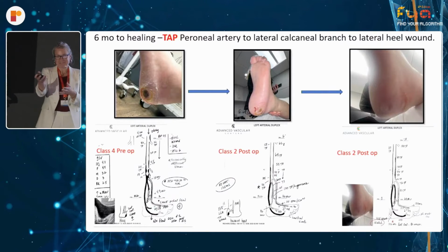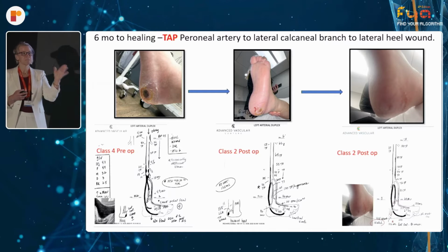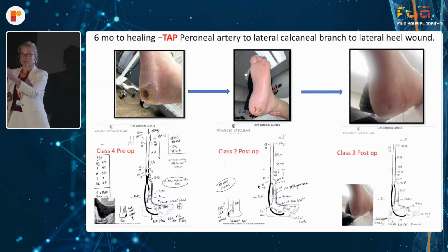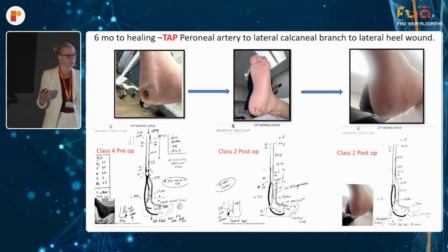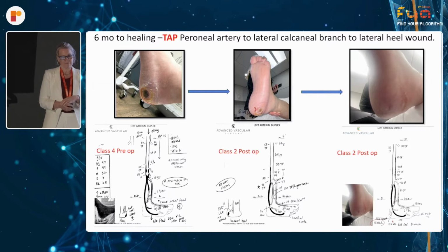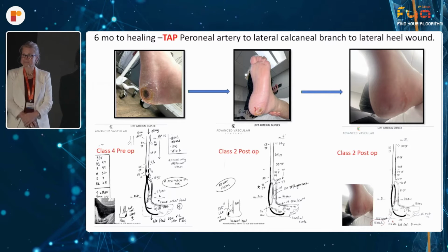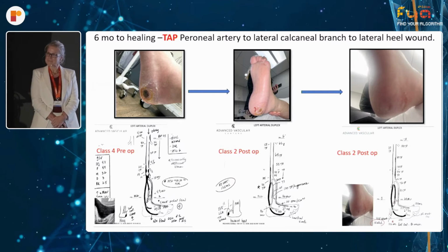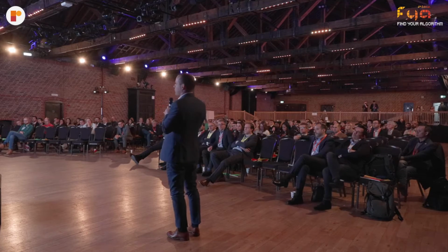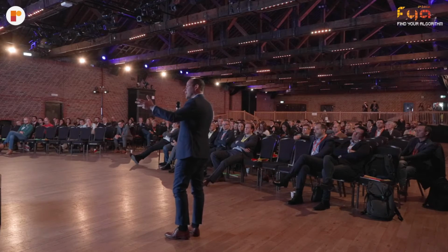So we often have conversation, Lorenzo and I, about, does PAT hold true throughout the course of time? And the answer is yes, unless there's an interval change like an occlusion or a high-grade lesion or vessel recoil, PAT stays true over time. That's something that for me is important, because many times we see, oh, we do an angioplasty and then it will develop more collaterals, or we think that things change, but actually your data are saying the opposite.